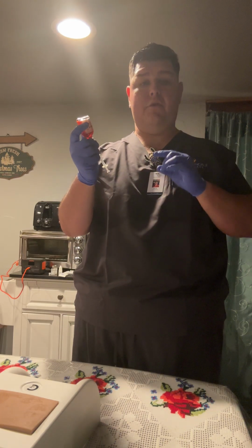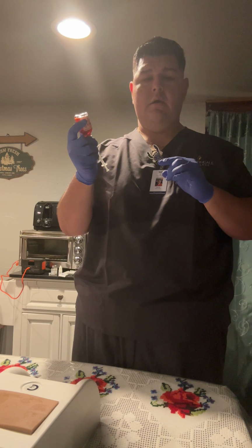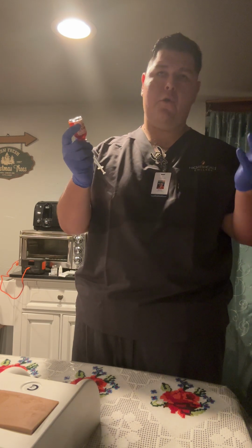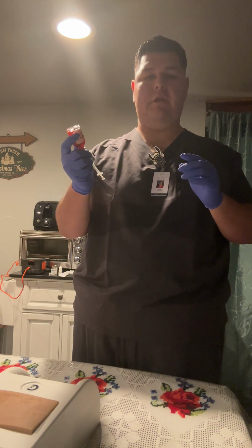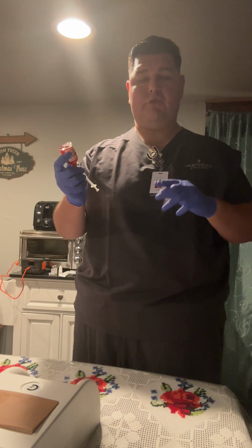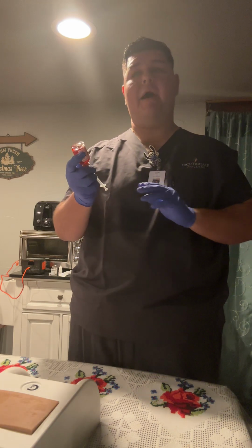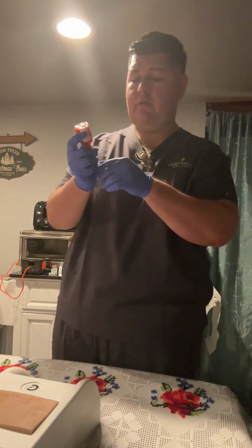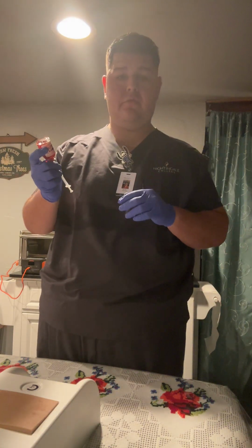They can get stuck in the syringe. So I just need to flick the syringe a little bit to have the bubbles move up to the top and essentially disappear. Sometimes injecting the solution back into the vial and drawing it back up might help. Okay, in this circumstance, there are no air bubbles present.